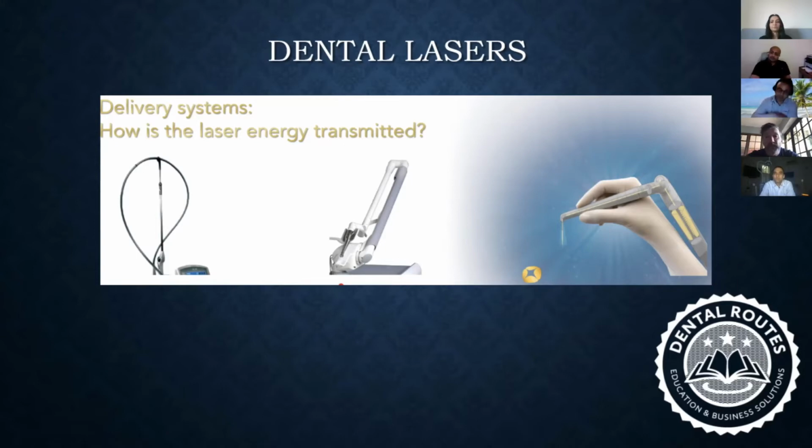Then, am I right in saying, Kushik, that ultimately they've used mirrors to deflect the laser itself in that articulated arm? Because obviously it's not going to go around corners. Yeah.